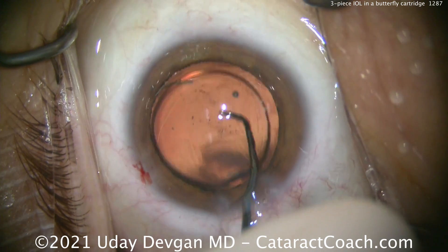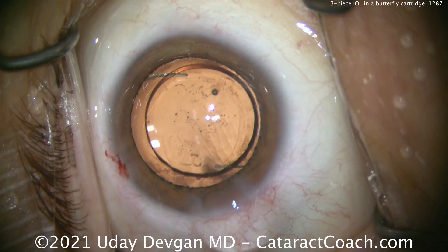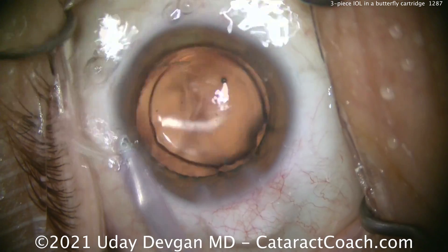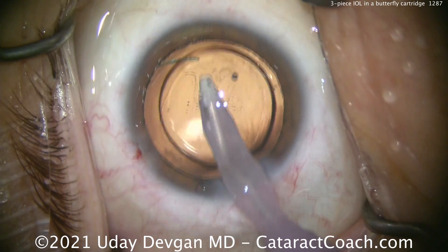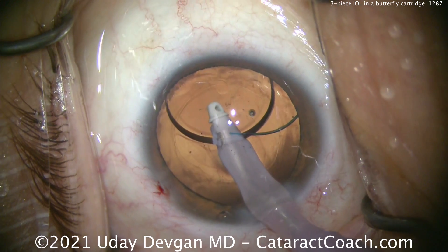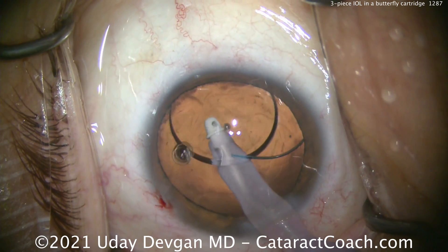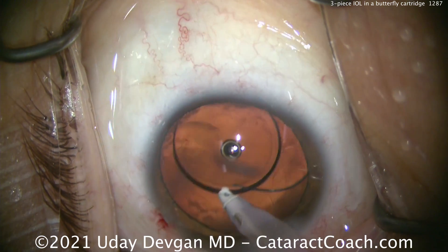The lens looks beautifully centered and now we can take out the viscoelastic from behind it. You can also use different manufacturers' lenses in each other's cartridges — we have actually used different manufacturers' lenses for their competitors' products.